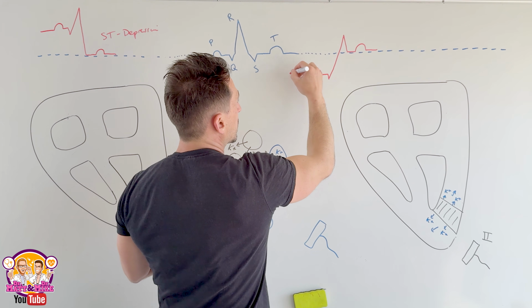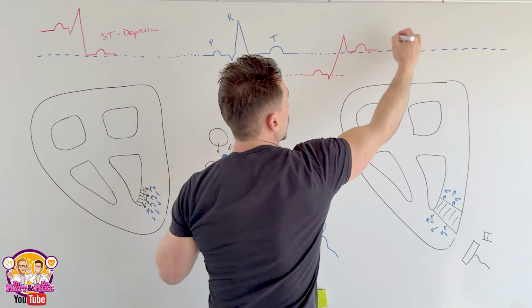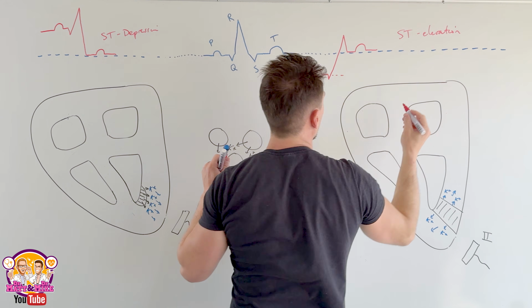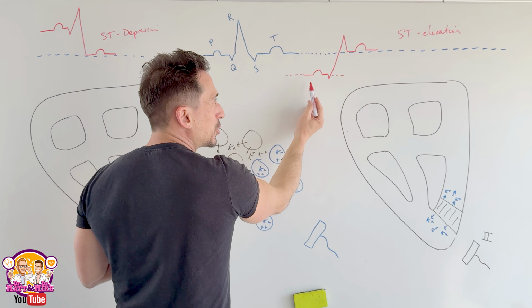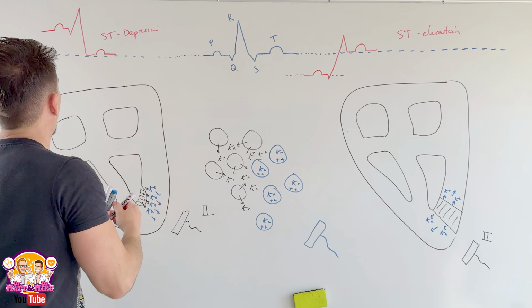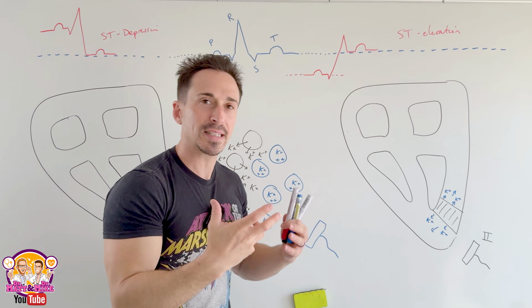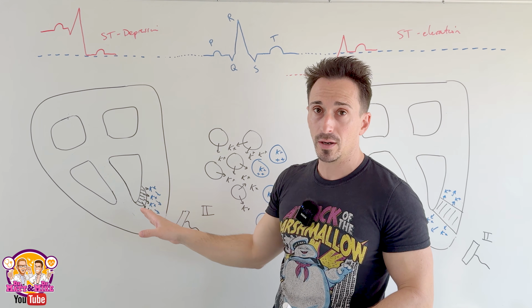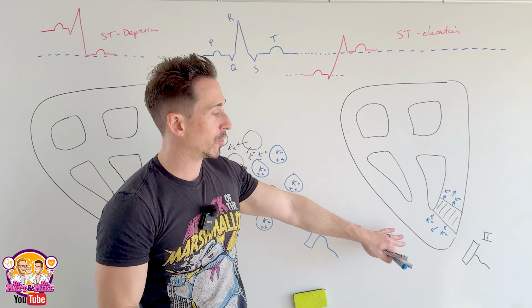So again, it's not that you have ST elevation, which we often call it. We have everything else depression, right? So I hope that helps make sense of what's going on when somebody has a heart attack, either subendocardial or it's progressed even further and they've got transmural.